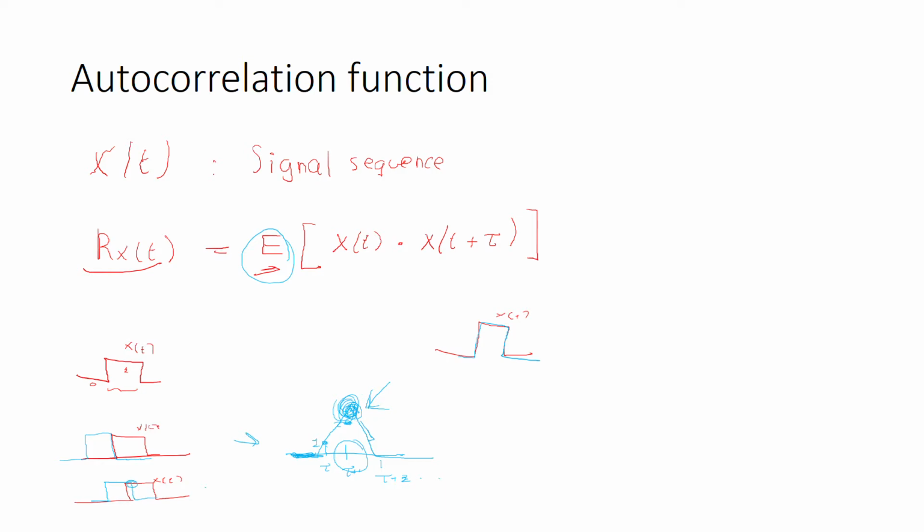If the highest result is not the expected value, it will tell you that probably you will have an error or a mistake in such communication.